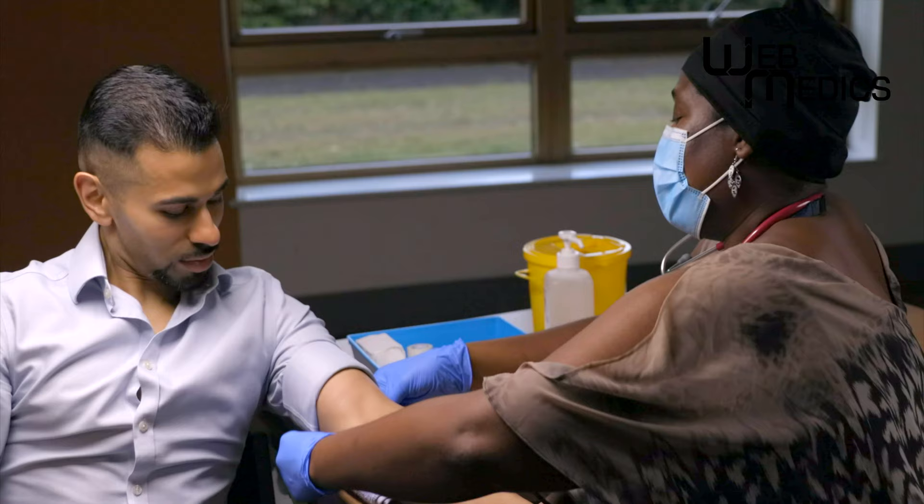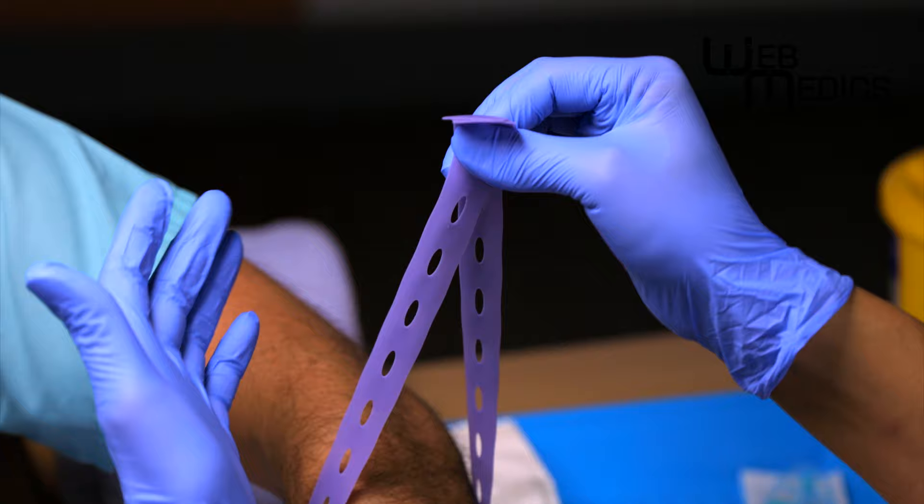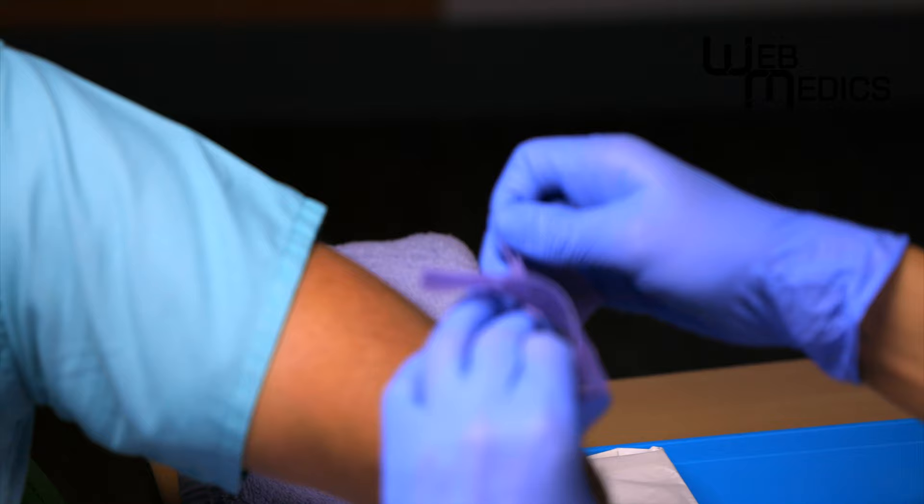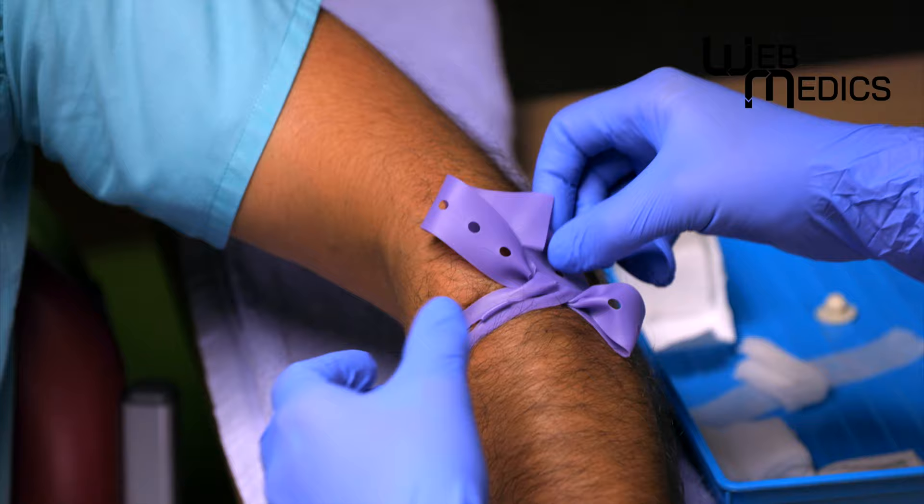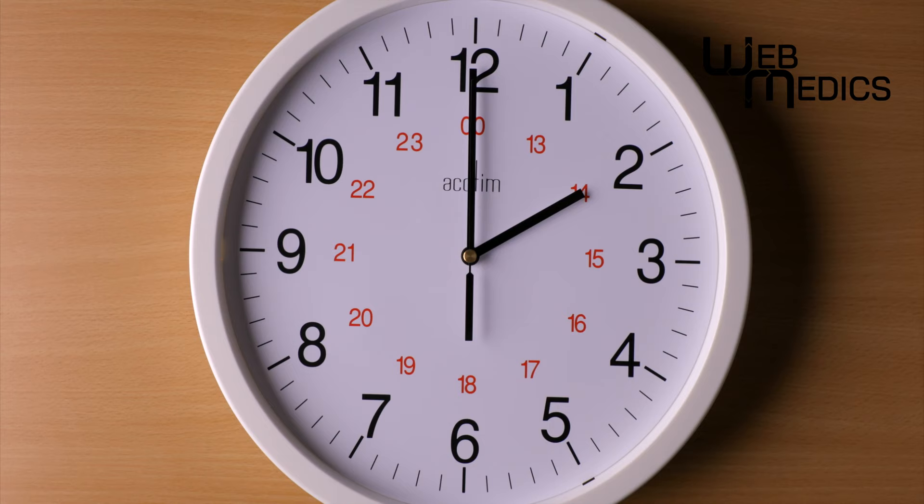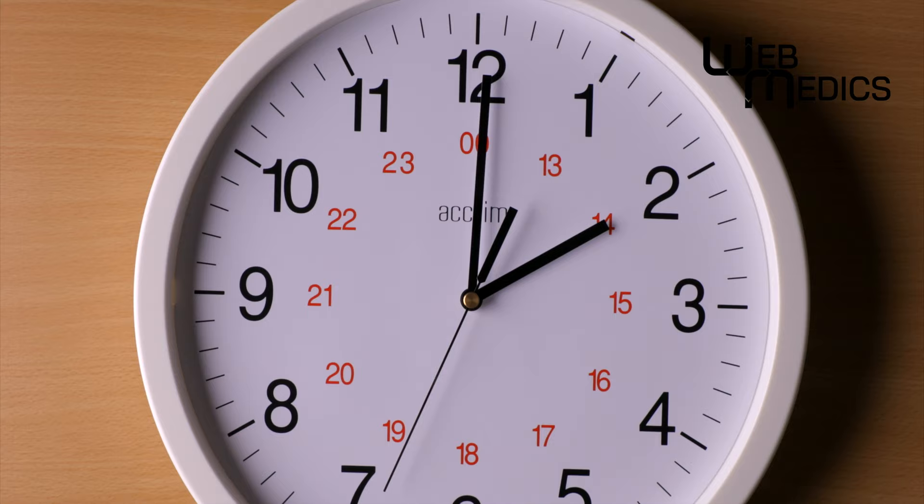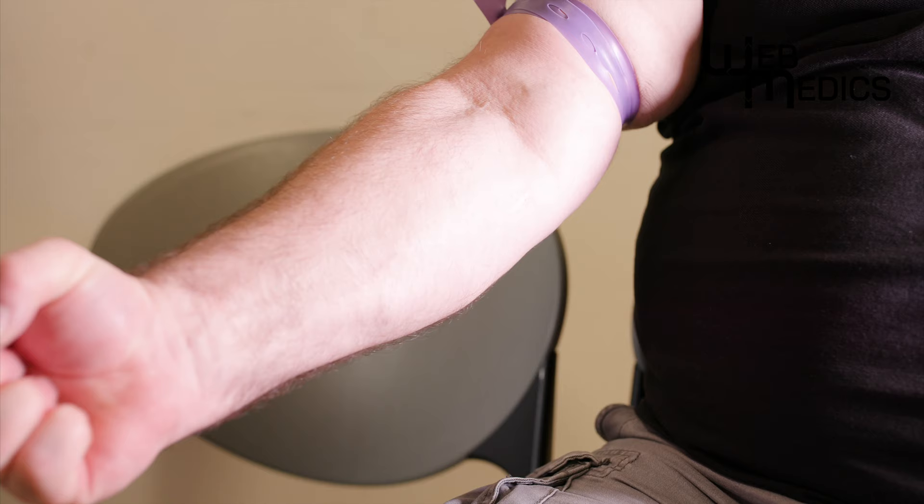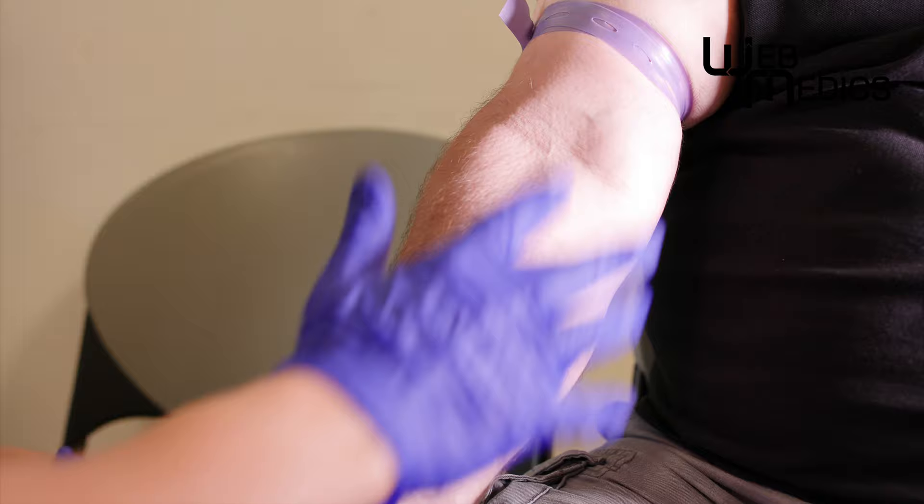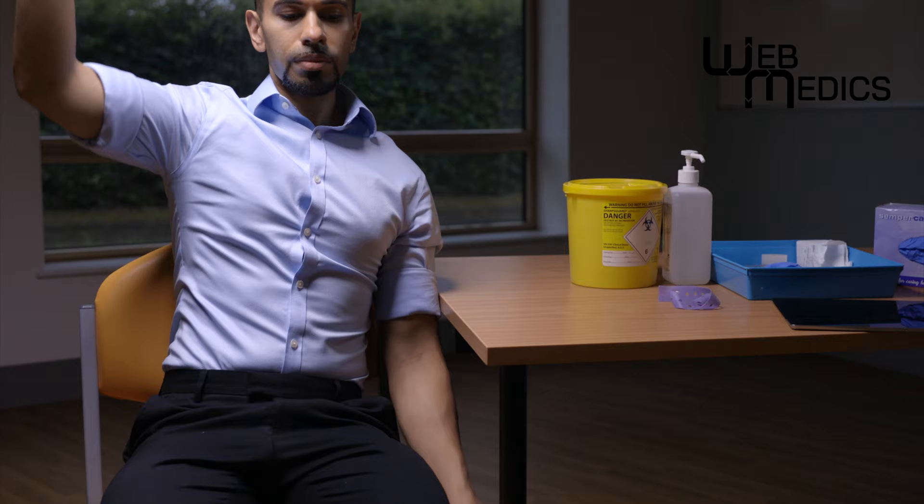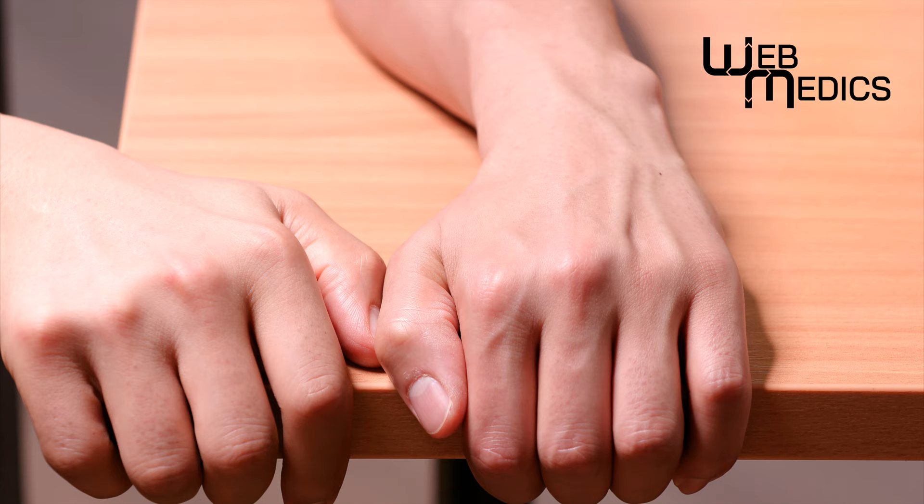We can apply the tourniquet between 7 and 10 centimeters or 3 to 4 inches from the point of puncture, far enough to avoid our sterile area, close enough to maintain adequate pressure in the vein. We can use a quick release knot which increases tension and reduces pinching, making it faster and easier to remove, keeping it on for a total of less than 60 seconds in order to prevent falsely elevated potassium and hemoconcentration. Instead of resorting to fist pumping and vein tapping which can also cause the same problems, we can use gravity before applying a tourniquet to help fill up the veins.